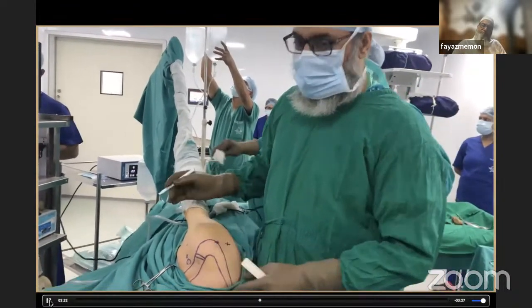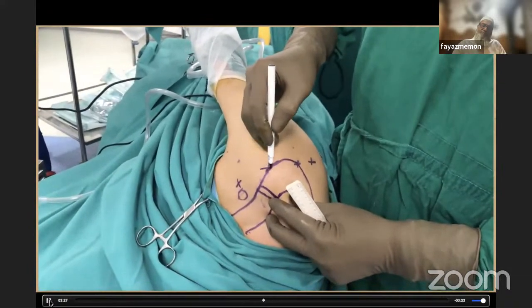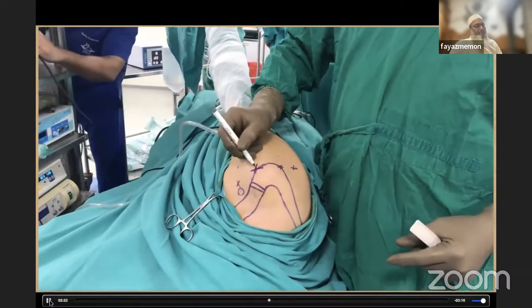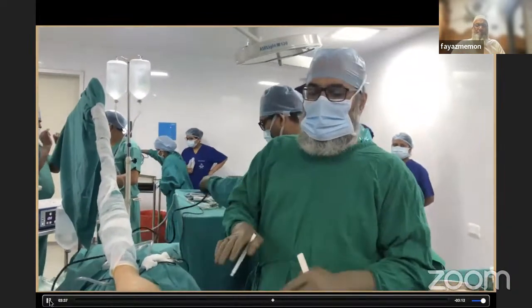And the third portal that we require in case of a Bankart repair is this anterosuperior-lateral. It is just at the corner. So you just insert from here inside the joint, and you find that it is going through the rotator interval.